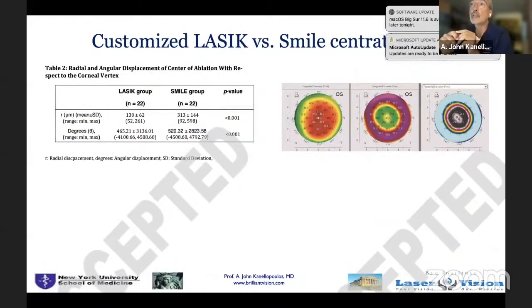And last, this is another study from that same study, a spin-off project, and I'm closing with this. We looked at the topography change with a Pentacam before and after the procedure. And you're seeing here an example on the right. So we were able to take this topography image from the Pentacam. So this is a tomography image, the difference map at a week.